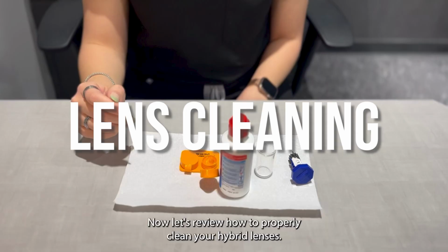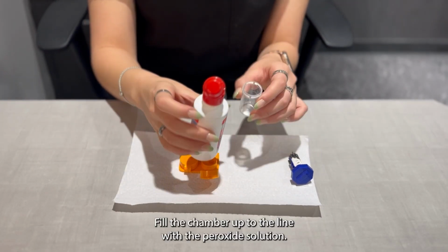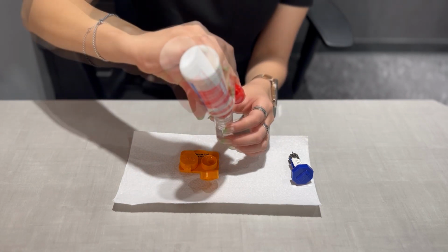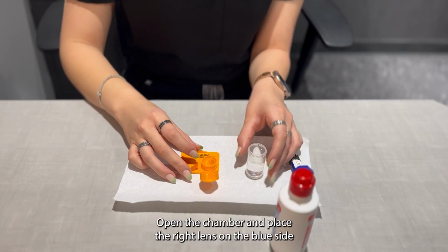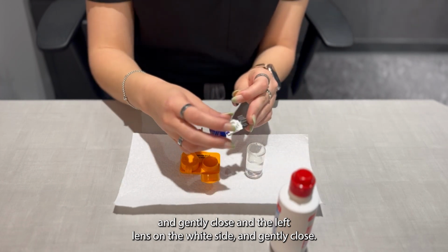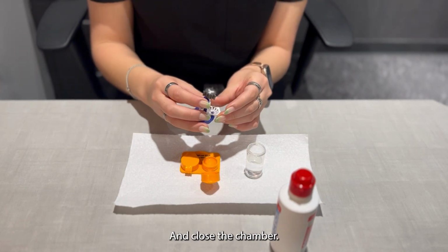Now let's review how to properly clean your hybrid lenses. Fill the chamber up to the line with the peroxide solution. Open the chamber and place the right lens on the blue side and gently close, and the left lens on the white side and gently close, and close the chamber.